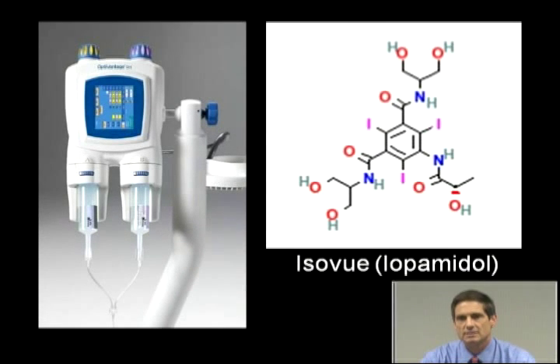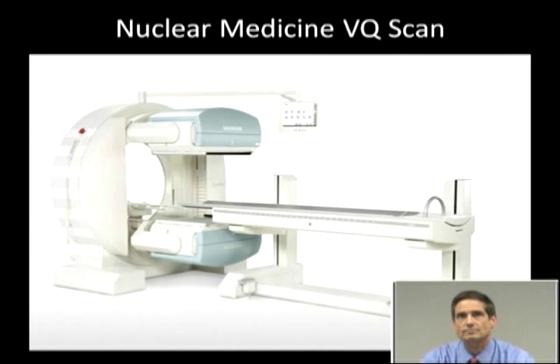Of course, with the CT scan, you want to use contrast material. Typically, that's injected into the patient with a power injector, and nowadays pretty much everybody uses non-ionic contrast material, which has fewer side effects and is more benign for the patient.